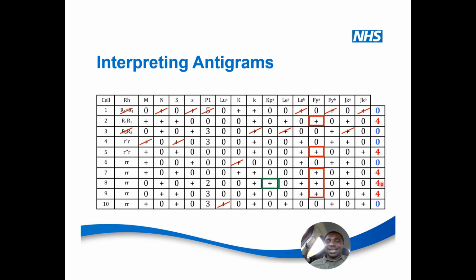Now let's look at the practical example, and I'll go straight to where it is marked red. Even though M here is 0, M here is 0, M here is plus, M here is of course plus because it's 4, 0, 0, okay? But look at cell number 4, it is positive, but cell number 4 on the patient result is negative.